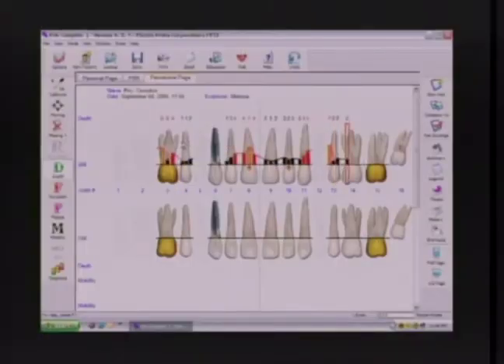The first one is, I'm probing a healthy patient. 2, 3, 3, and all of a sudden I hear something like, danger, 8. Is that possible? Sure, but the point is I want to reconfirm it. So number 1, I heard it instantly, and I want to reconfirm it.